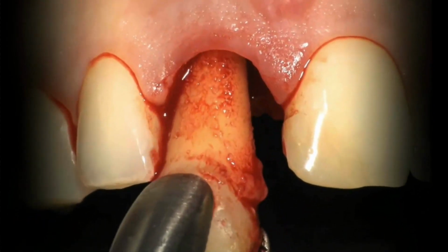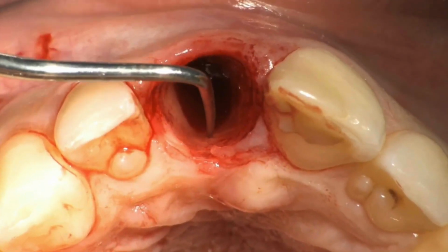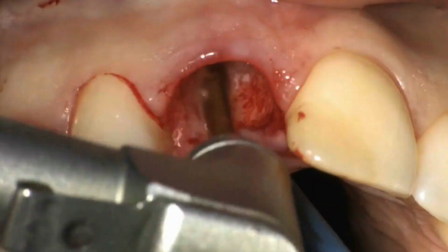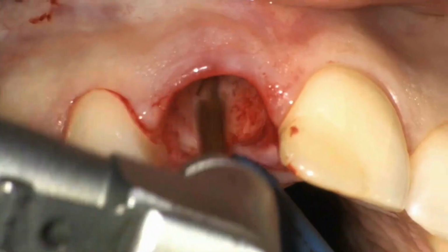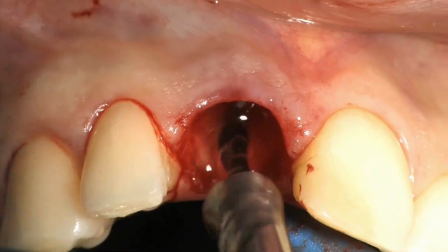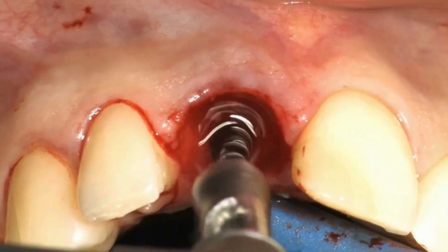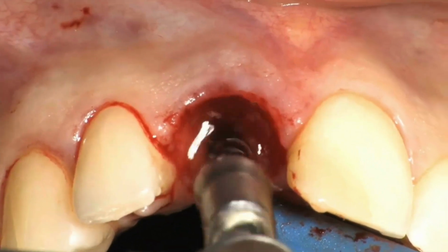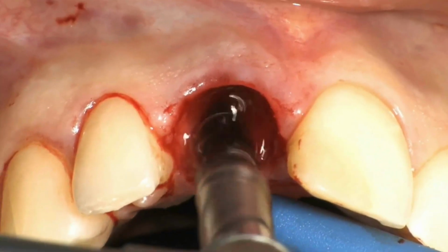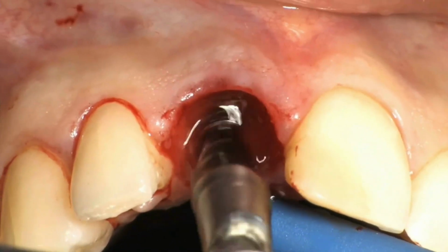We first proceed with a very atraumatic extraction. Then we're choosing the bone site which is appropriate for implant placement, and we're also making sure that the buccal plate is intact. You see the drilling process. This can be guided. This can be within a digital planning protocol, or it can be a laboratory fabricated acrylic transparent guide with the full contour of the tooth in place.